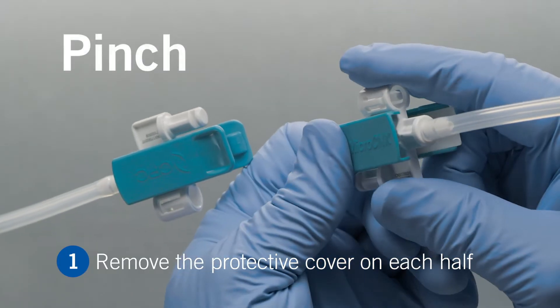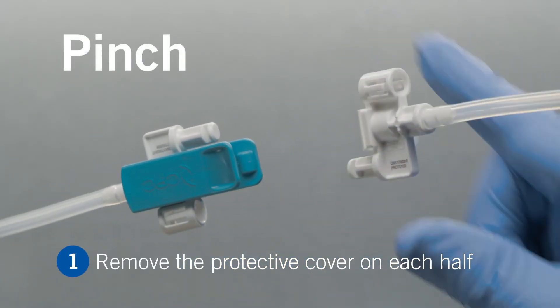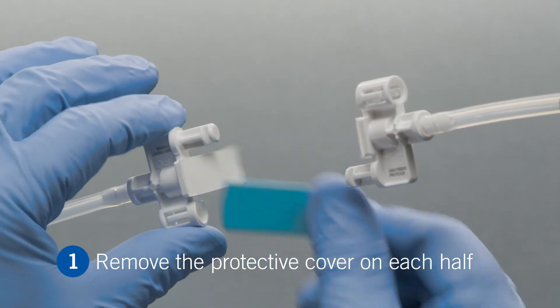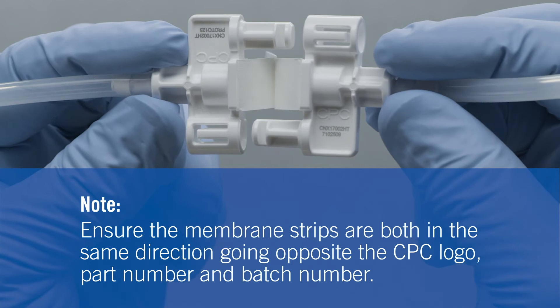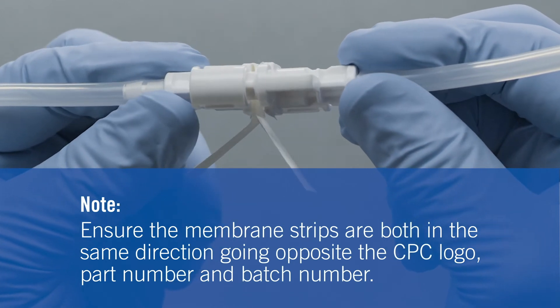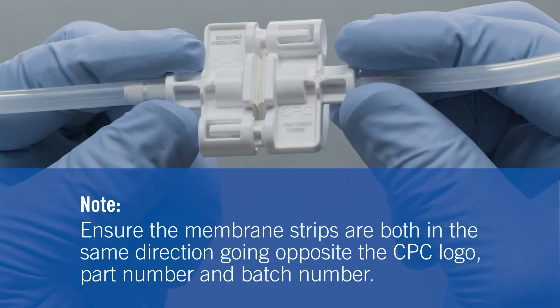First, remove the protective cover on each connector half. Before connecting, ensure the membrane strips are both in the same direction, going opposite the CPC logo, part number, and batch number.